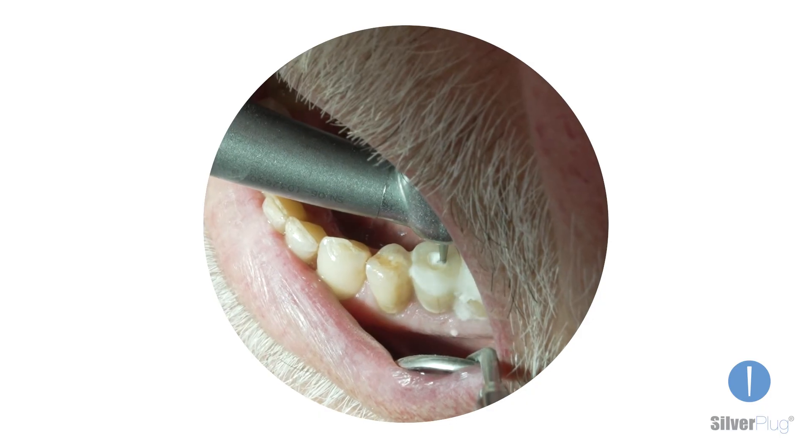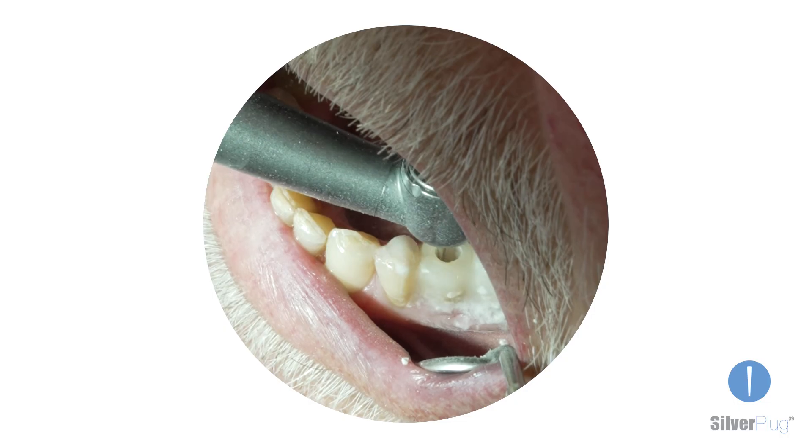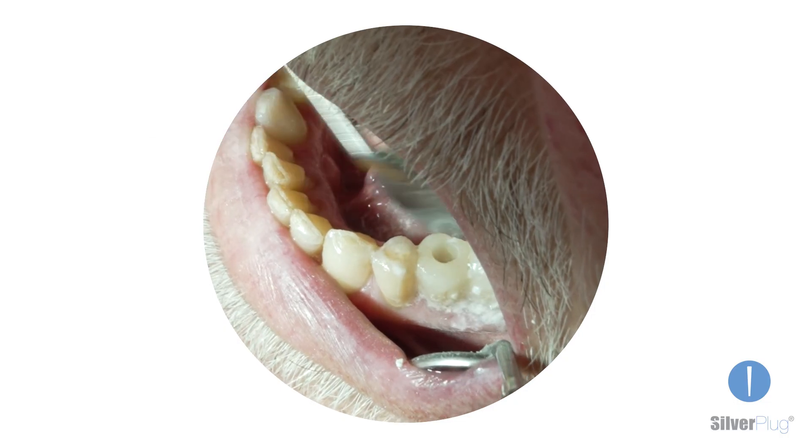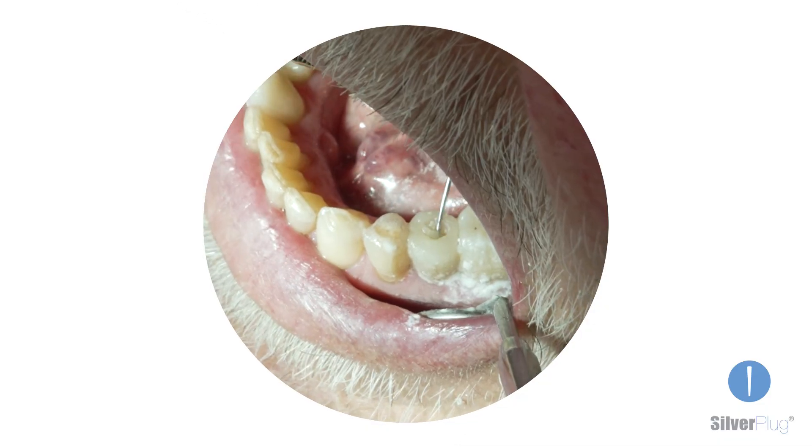Removing Silverplug is just as easy. Simply remove the composite, engage the Silverplug section with a probe, and pull the product out with a rotational movement.